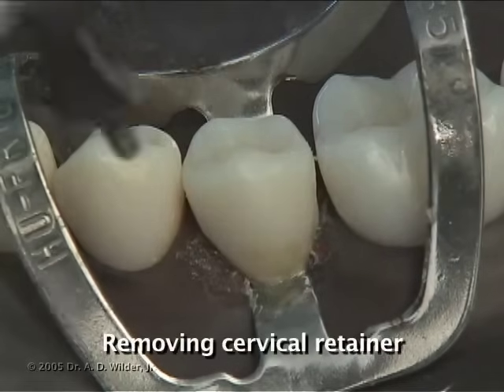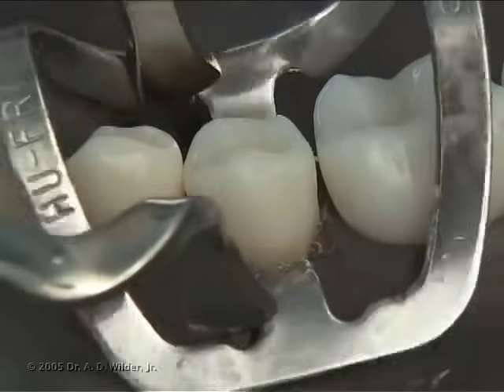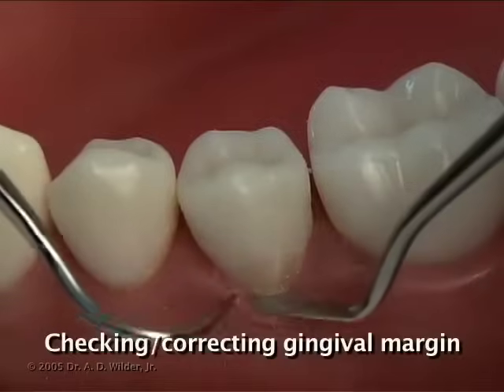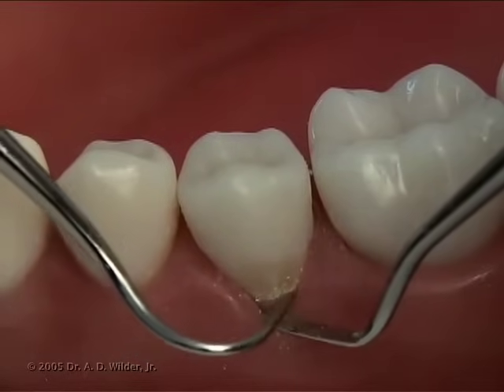You can then remove the rubber dam retainer and the rubber dam. Once this is complete, you can get a better look at the gingival margin and if any corrections or adjustments need to be made.